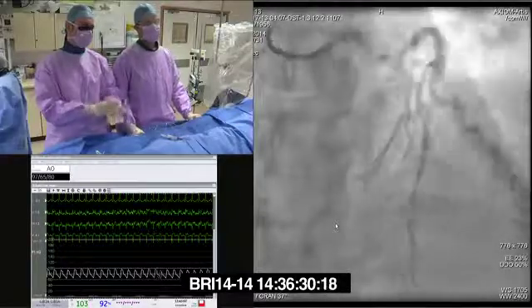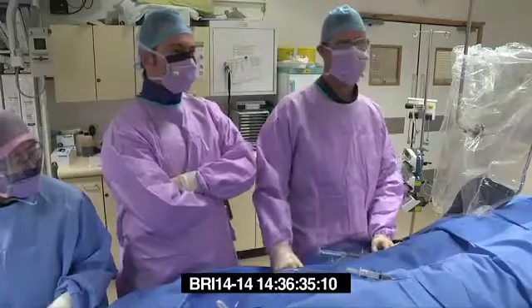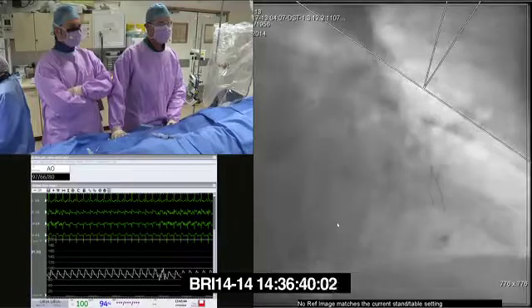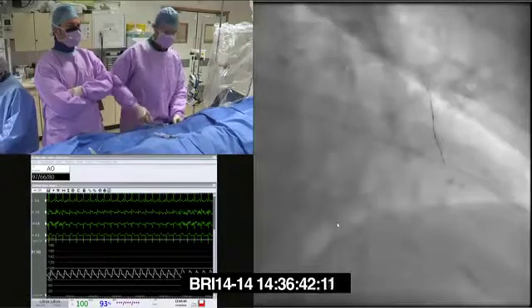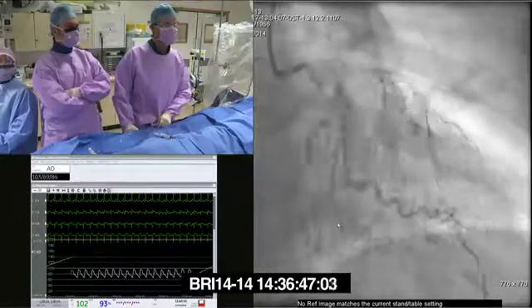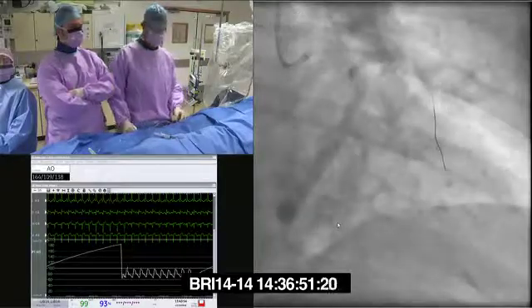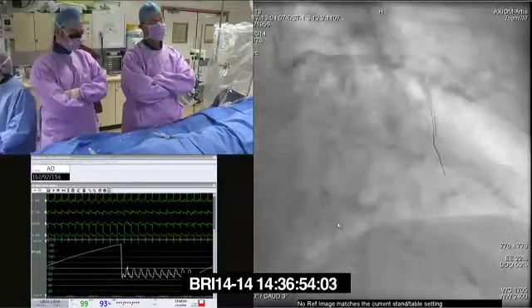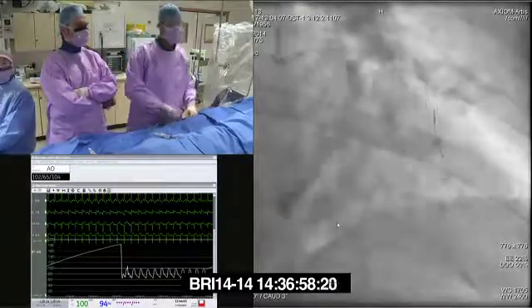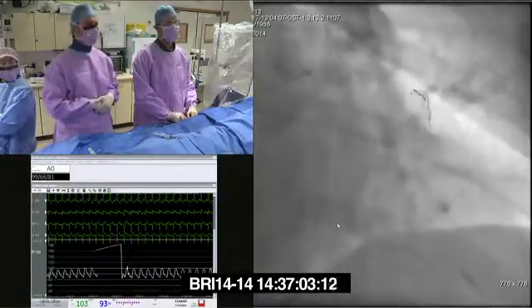There's obviously quite a jump down, isn't there? And then up again. Just come RAO straight, please. Then I'll just do a long shot there, no panning, and see what we got perfusion-wise. It's interesting actually, with it on the less stiff part of the wire, it looks less crimped. Just going to bring that back.